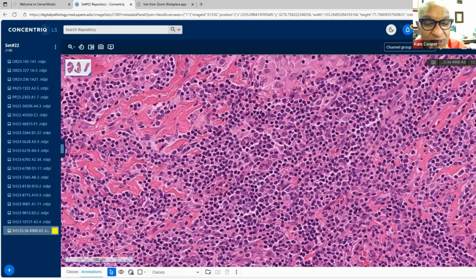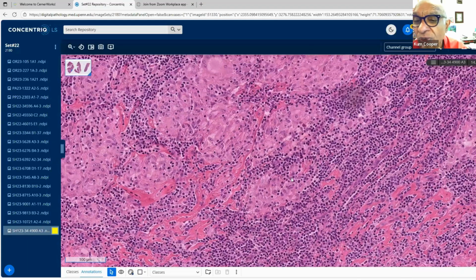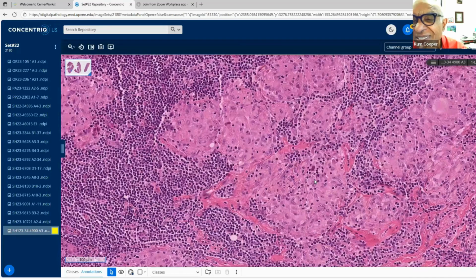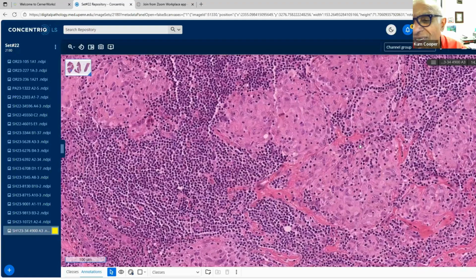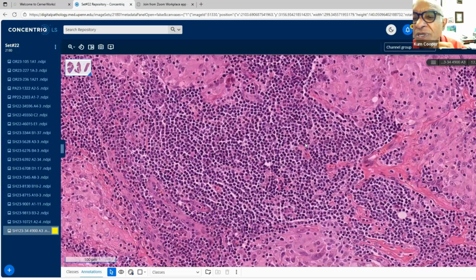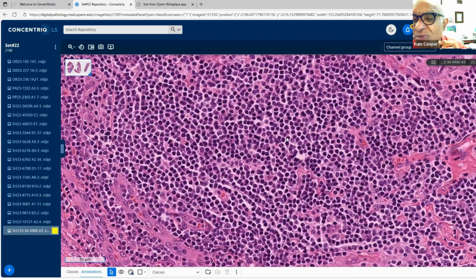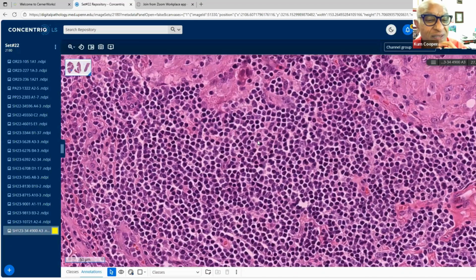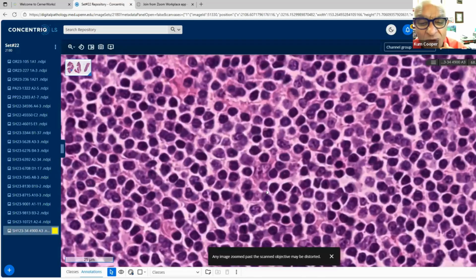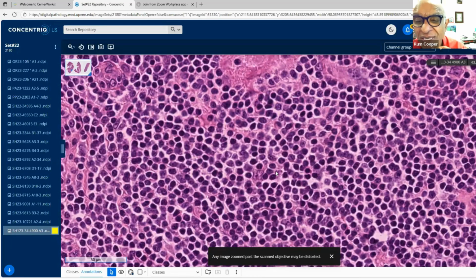But then in between, in the lymphoid stroma, there are these large cells, prominent nucleoli. Here's another here. Here's another here. And then now they start to pop up. You can see them coming up quite frequently. Large cells, prominent nucleoli, vesicular chromatin, and irregular nuclear membrane. There's a nice one there as well. Okay. So yes, there is a granulomatous lymphadenitis, yes, but there are these large cells in between.